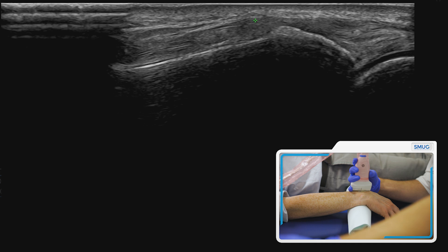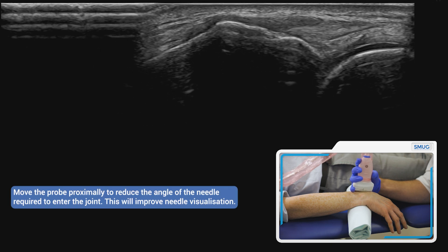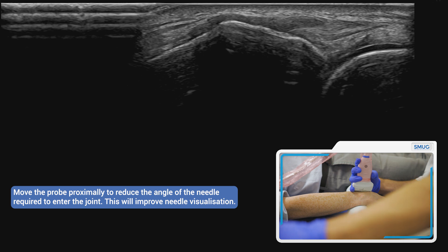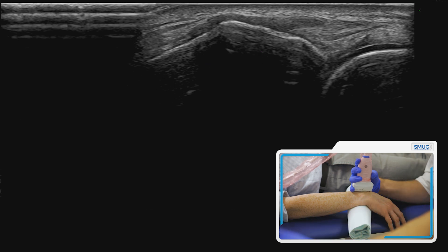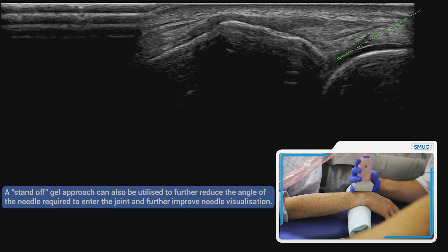If you start with the probe in this sort of position, you can see it's going to have to be quite a steep angle, which means you won't see the needle tip quite so well. So if you just come backwards slightly — remember, the more parallel you are to the probe the better you're going to see the needle tip — you could then come in at about 30 to 40 degrees, which is going to be much better visualisation.